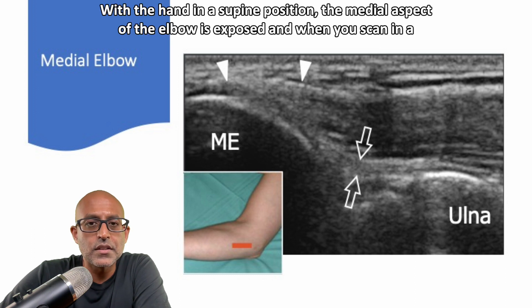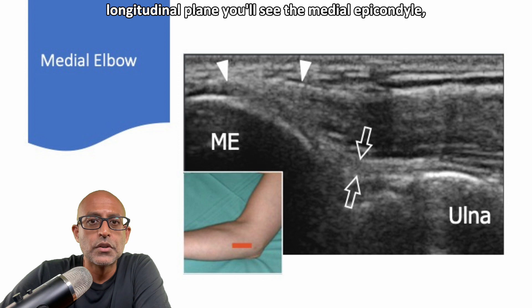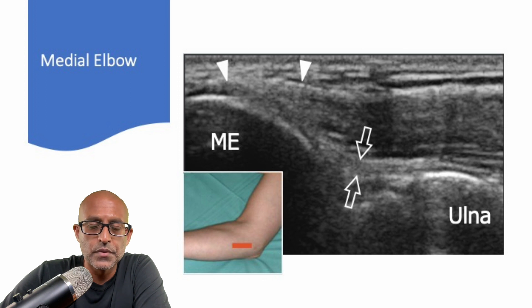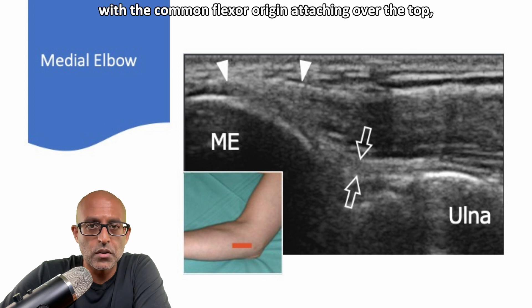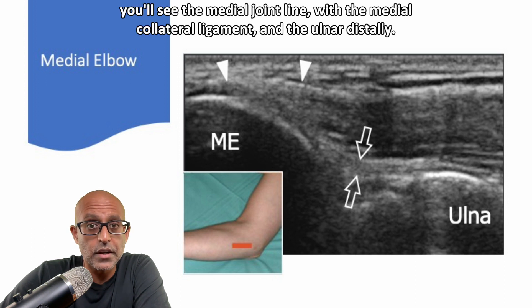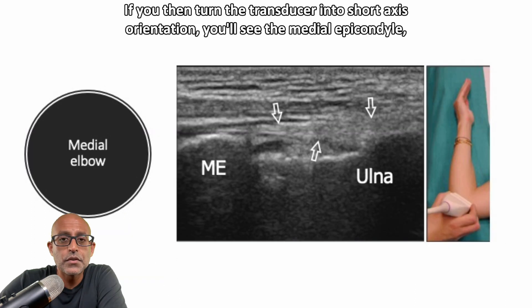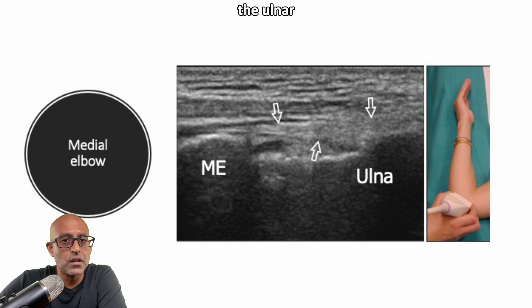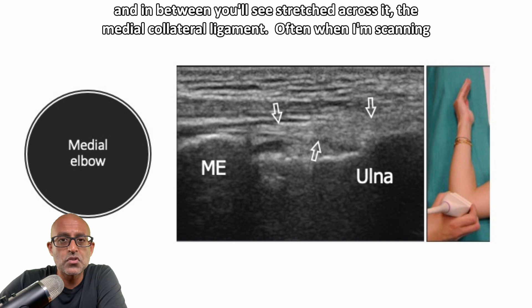With the hand in a supine position, the medial aspect of the elbow is exposed. When you scan in a longitudinal plane, you will see the medial epicondyle with the common flexor origin attaching over the top. You'll see the medial joint line with the medial collateral ligament and the ulnar distally. If you then turn the transducer into a short axis orientation, you'll see the medial epicondyle with the ulnar, and in between, you'll see the medial collateral ligament stretched across it.